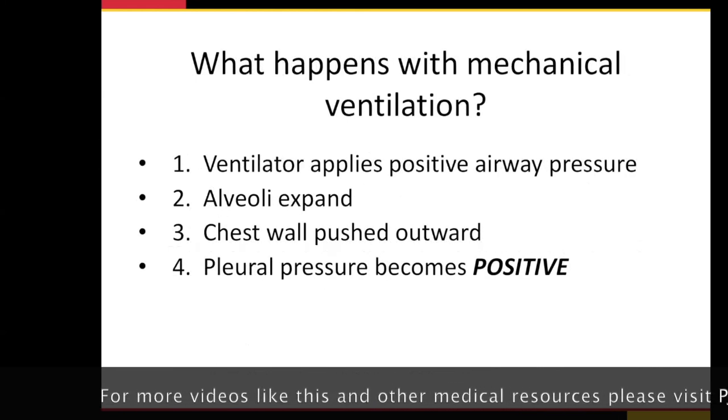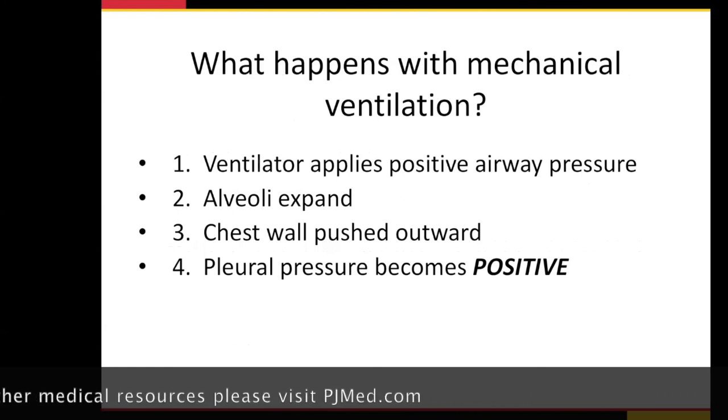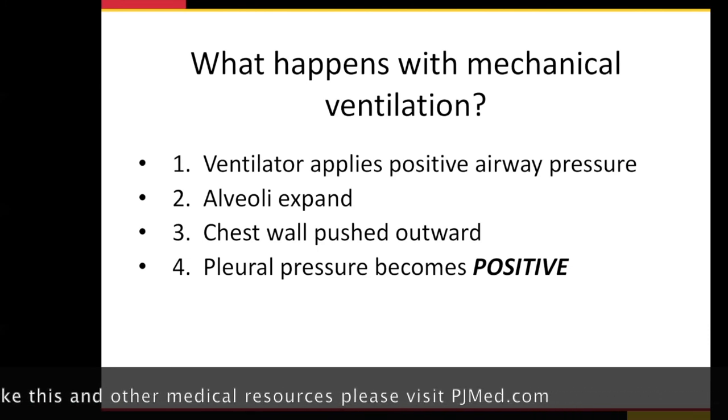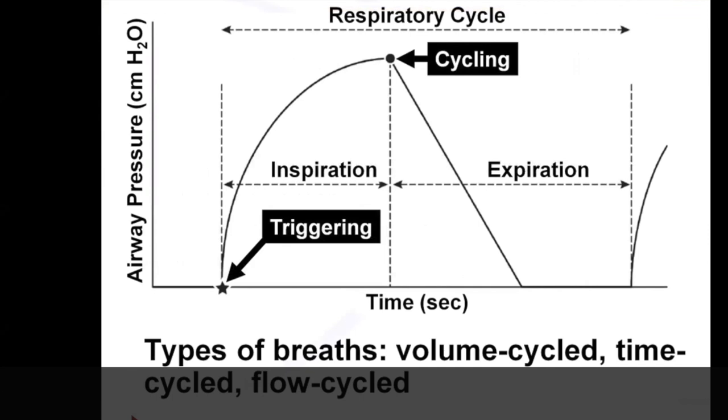So let's go through what actually happens. When you put somebody on mechanical ventilation, it's actually a fairly significant physiologic event. You're reversing all their physiology. That's what basically you're doing. You're putting positive pressure on, expanding the alveoli, and pushing the chest wall outwards. And importantly, the pleural pressure becomes positive. So normally as we breathe right now, it's negative. So you're reversing the physiology. Just remember that. That has a lot of consequences.